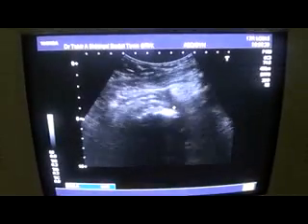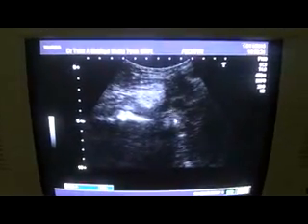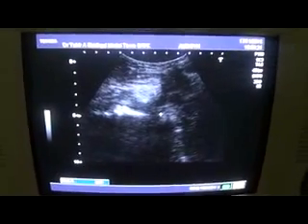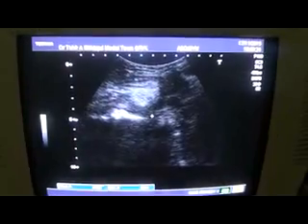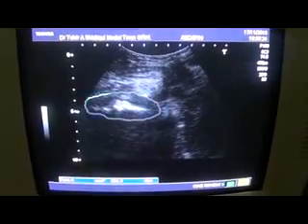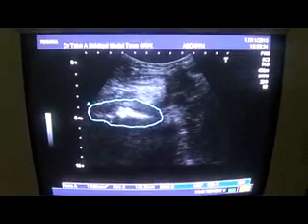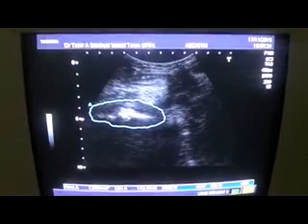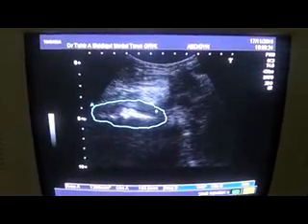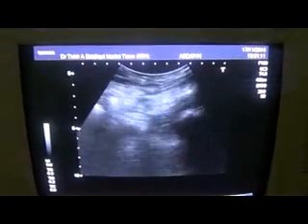From where this bowel segment starts, this is the implanted ureter. This is the implanted ureter, and this is the bowel. This is the bowel segment giving dirty shadow and downwards. This is the collapsed lumen with gas, and here you see the dirty shadow from it, and this is the implanted ureter, and this is the urinary bladder. So it is also giving pressure effect. This bowel mass is giving pressure effect on the ureter.